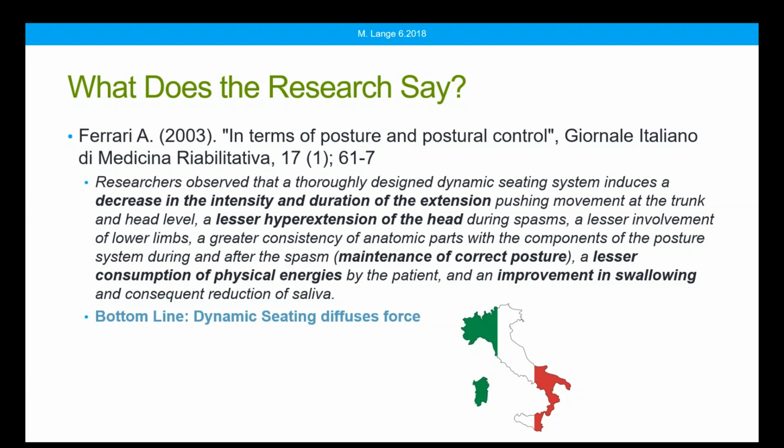That's kind of a mouthful there. But what they're basically saying is that the client remained in alignment with the seating system. So we didn't have that shear, that movement of the client within a static seating system. So the correct posture was maintained, and there was reduced amount of energy exertion. They, like the Crane study, also found improvement in swallowing and a consequent reduction of saliva. So bottom line here, dynamic seating was found to diffuse these forces and have other benefits as well.